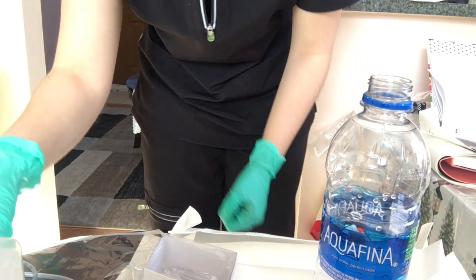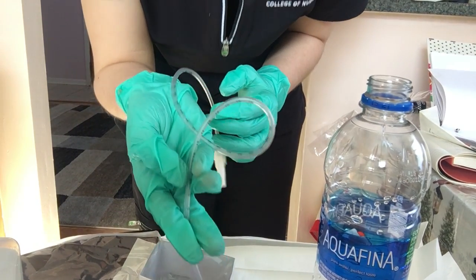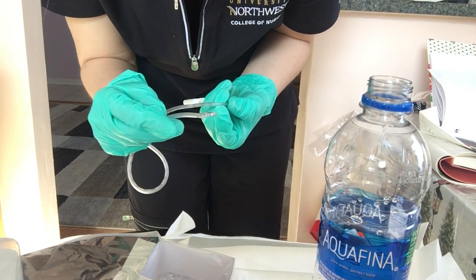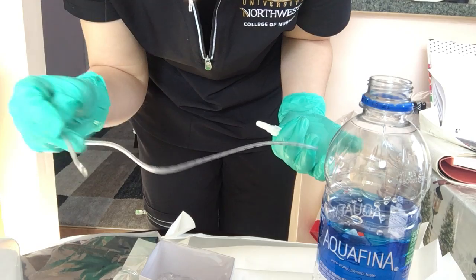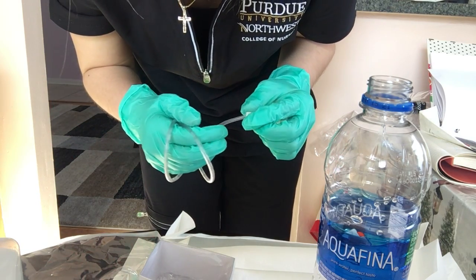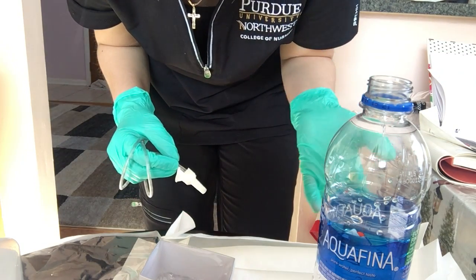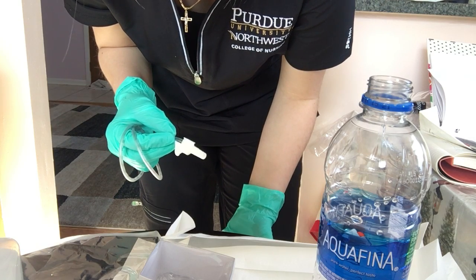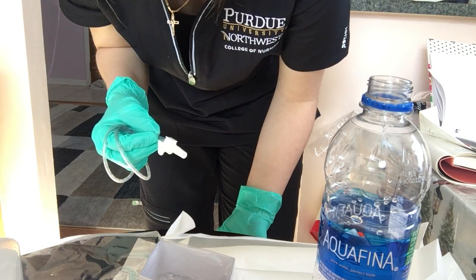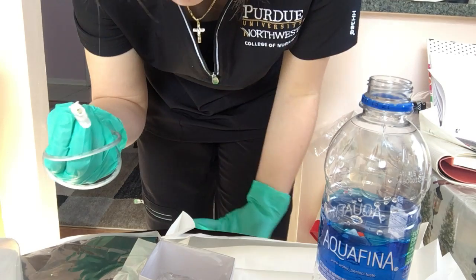So then we would flush the catheter with saline and assess the effectiveness of the suctioning, and we would repeat as needed according to the patient's tolerance. We would then wrap the suction catheter around our dominant hand between attempts. So we would allow at least 30 seconds to 1 minute intervals if additional suctioning is needed, and you have to make sure not to make more than 3 suction passes per suctioning episode. And we would also encourage the patient to cough and take deep breaths in between suctioning attempts.